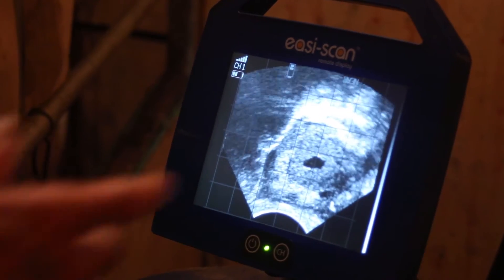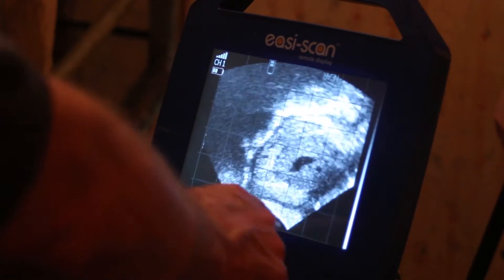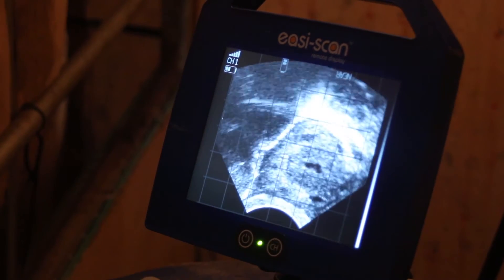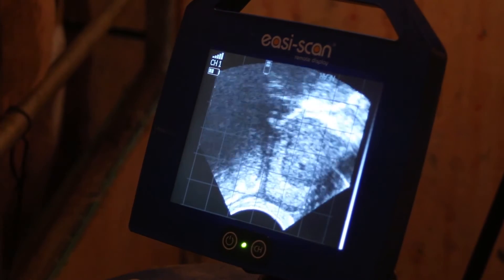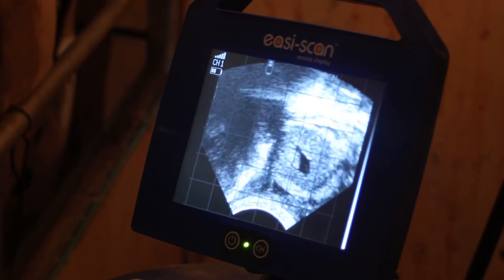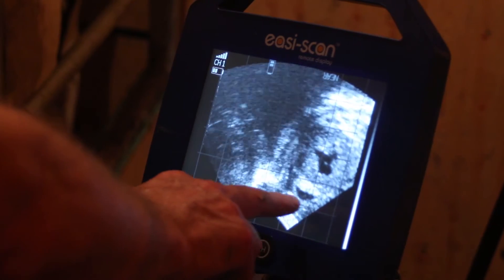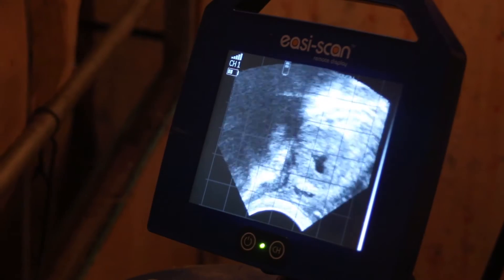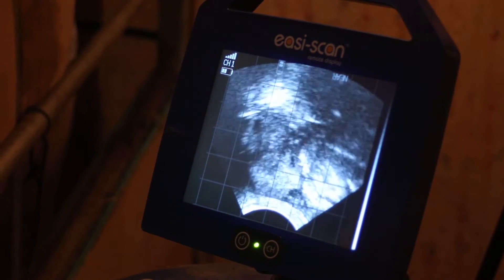So on the screen now you can see that the corpus luteum and the lacuna are still there, but there are very much fewer follicles around the edge. You will also see some follicles which have been collected from but are now filling up with blood, and we've got some slightly cloudy fluid inside them rather than the dark black fluid that was originally there. That was the big follicle I collected originally and we can see some slightly cloudy fluid or blood now filling that space. So we don't want to go back in there again — we can leave that alone and concentrate on those follicles with the dark black fluid in.